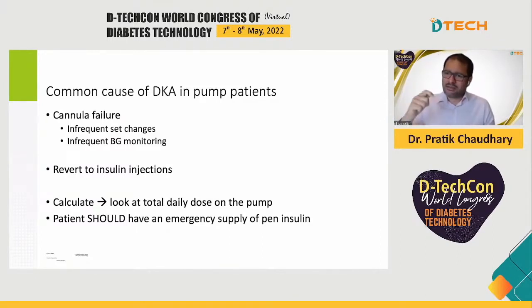And when they've changed their cannula, sometimes if that second cannula is kinked, they are thinking that things are okay, sugar levels are high, and by morning they're in DKA. So that's something that's really important.